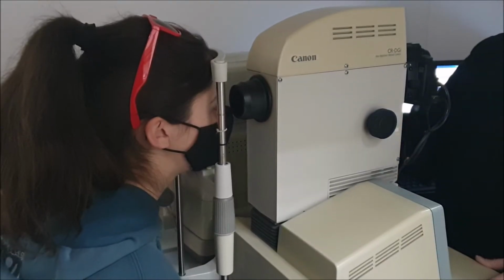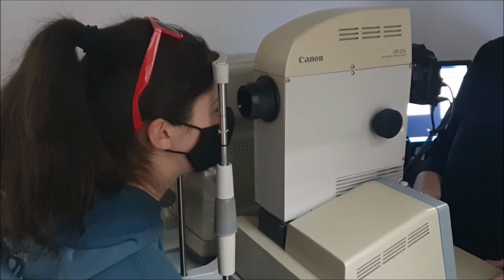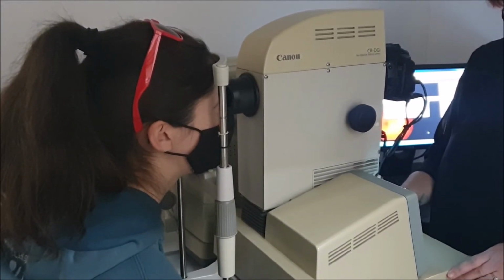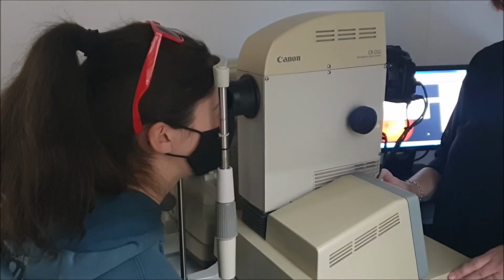And you can see it because this machine takes a picture of your retina. You basically lean your head against the stuff again, you look in, you see a green dot and then a bright flash, which makes everything glow red for a second. Basically what that does is it takes a picture of your retina and then it shows up on the computer screen where the optometrist can look at it for any abnormalities. It takes a picture of one eye at a time, so the machine moves a little bit, takes a picture of the other side, and then you're good to go. It is a pretty bright flash, so prepare yourself for that, but it's not really frightening.